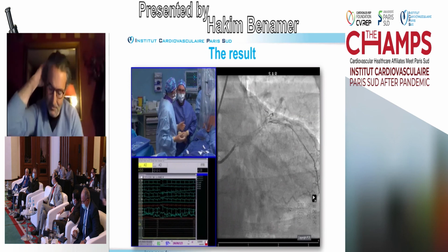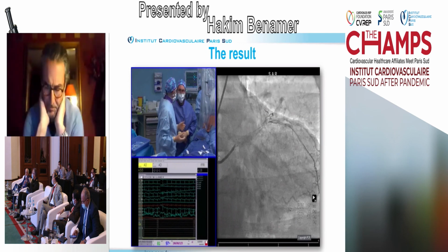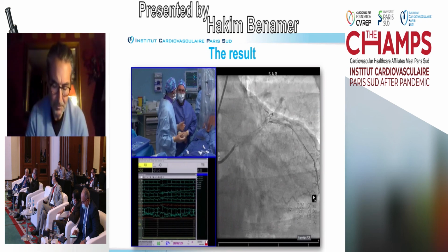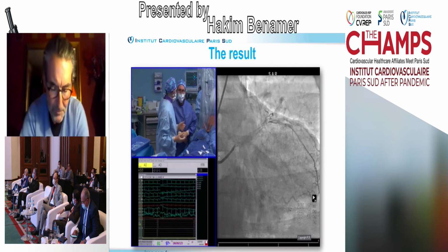When I finish this procedure like that, I usually finish my work by a final POT, because I usually expect that the guiding hits the proximal tip of the stent. So I usually terminate by a final POT. Yes, I fully agree with Dr. Khalid. Yes, especially if I have an ostial stent.